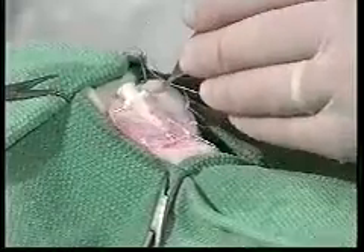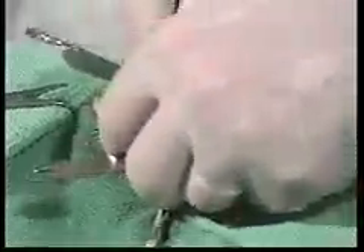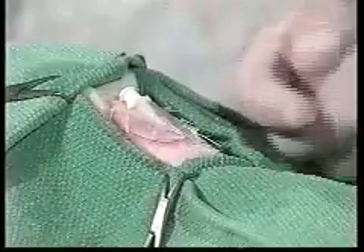Now we are finishing up the sutures, putting in this last suture. We just want to be sure it is secure and that the whole skirt is sutured snugly, but as you can see there is a little bit of space under each suture. I want to mention that in long-haired cats, if they start to get a lot of hair growing under there, you can remove a stitch, or I find it's pretty easy to just reach in and keep that hair trimmed. In the later part of the tape, we are going to talk about maintenance of the site.